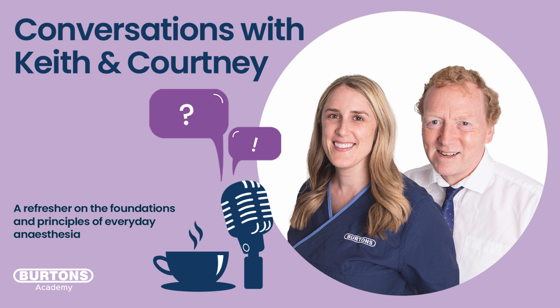And I'm sure you'll agree, Keith, we've got to be careful here almost, but using it intra-op in a healthy patient, it's more of a heart rate counter almost, because we're providing such a high flow, high concentration of oxygen. To see those differences in the theatre on our pulse ox, if it does read 92 or 91, either on such a high concentration of oxygen, is it really real?